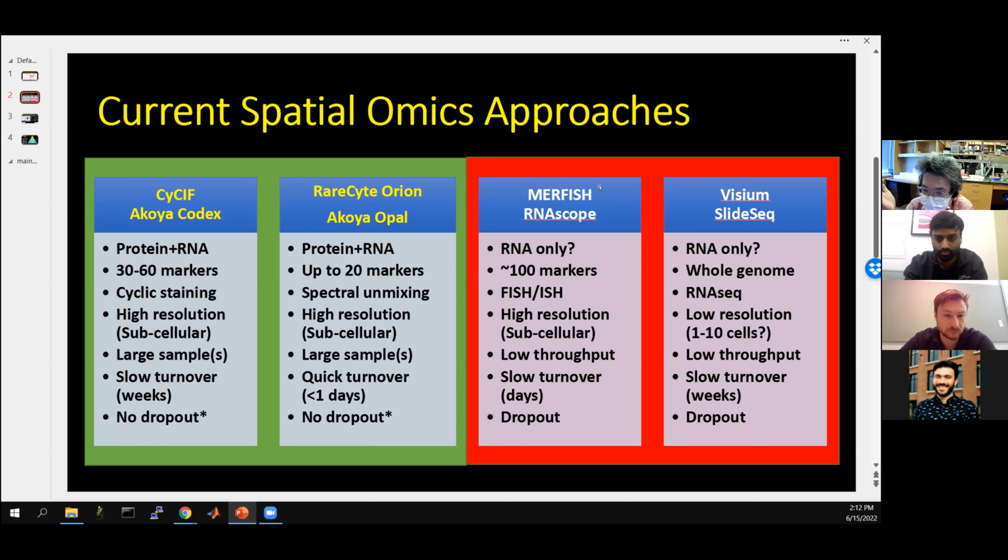But the other aspect, which is less often considered, is that with all these image approaches we can push the resolution as high as possible. So we have subcellular resolution as well as morphological resolution. This resolution can be multi-scale. We can see things as small as micronuclei inside the cell, and as big as the whole tumor.